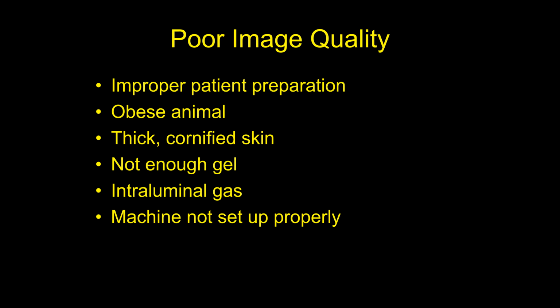You didn't take the time to clip the hair. Okay. It's got not enough lube. You didn't use enough gel. The gel that you put on the skin surface actually helps the ultrasound to get out of the probe and get into the animal. If you don't put gel on the skin surface, no matter how hard you push, there's going to be a very thin, finite layer of air between the probe and the skin surface, and ultrasound doesn't penetrate through air. Okay. And so you get a really ugly image. And so that's why you put that coupling gel, the ultrasound gel, on there.